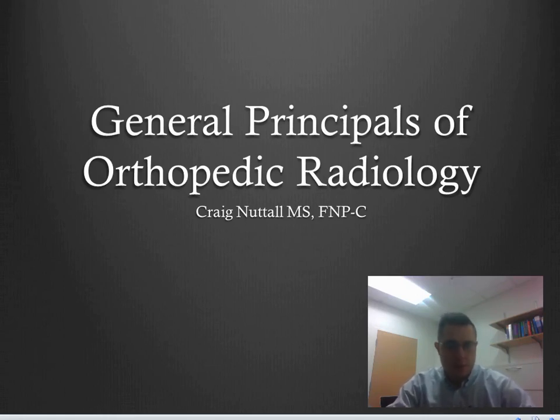Obviously, you're not always going to be reading these x-rays, and you're always going to want to get a double read or a radiologist to read the x-ray if you're ever in doubt, and probably all the time you're going to get it. But if you have an x-ray machine there in your office, you're able to look at that x-ray really quick before the radiologist is able to do their read. It's going to be a couple hours for them to get it back anyway.